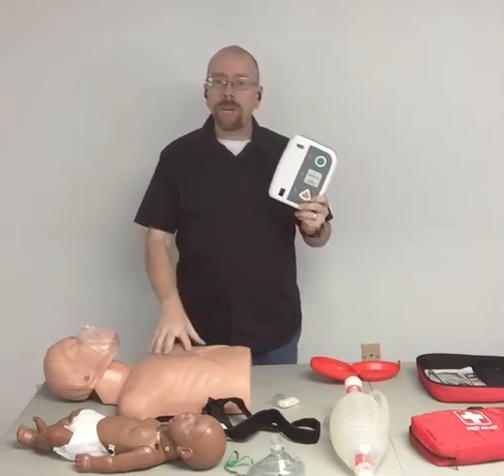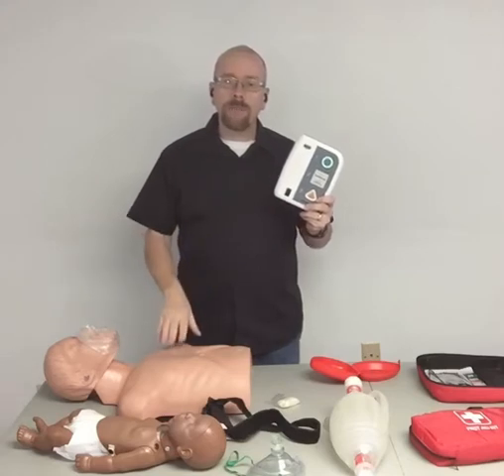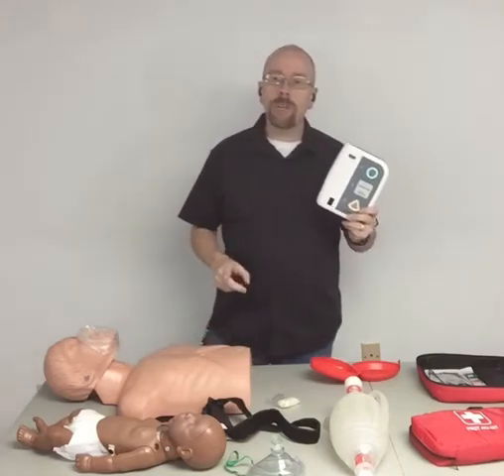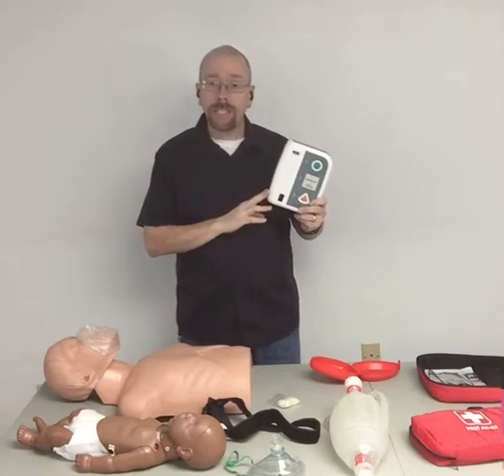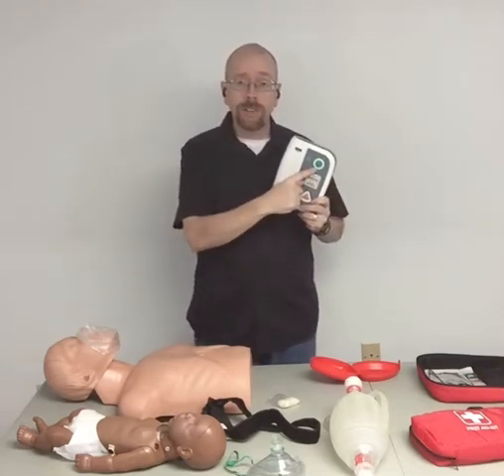We use this on the patient who is without a pulse. Often we do 2 minutes of CPR first to circulate oxygenated blood before applying the AED. The first step for using the automated external defibrillator is to turn it on.